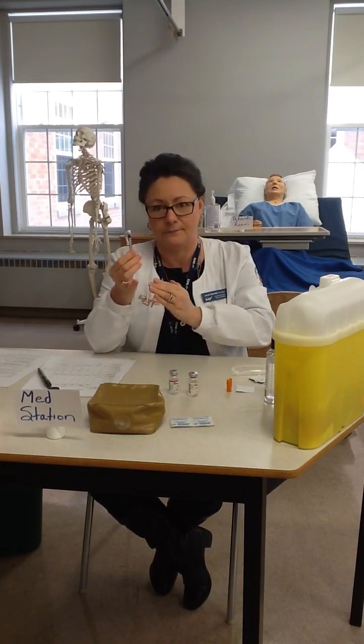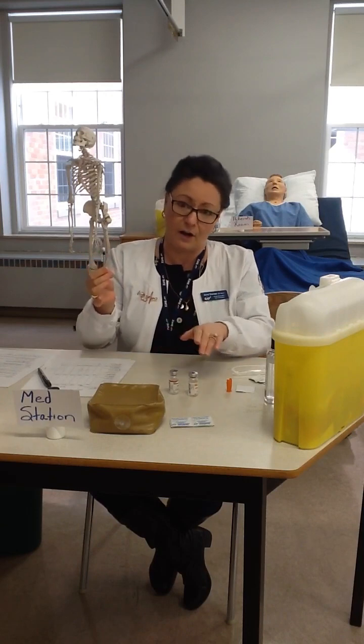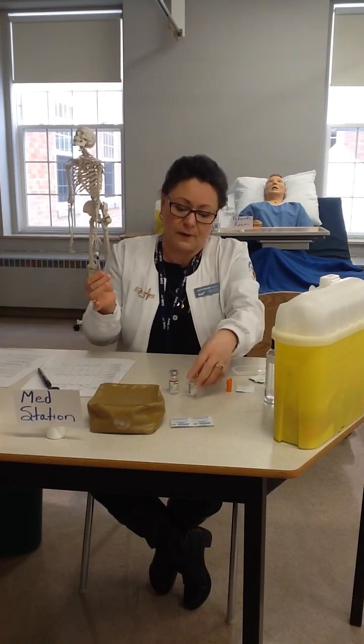So we always draw up, aspirate, the medication. With mixing insulins, clear before cloudy. So if I'm going to be drawing up the clear first, I need to work in reverse and add the air opposite. I want to finish over here with my R. Okay, so there's my cloudy. I've rolled it, just so you can see the cloudy.